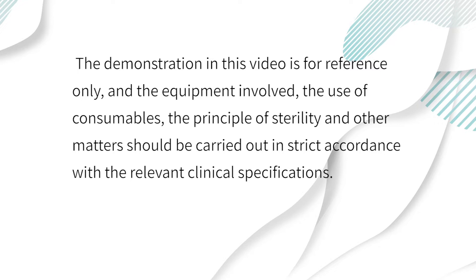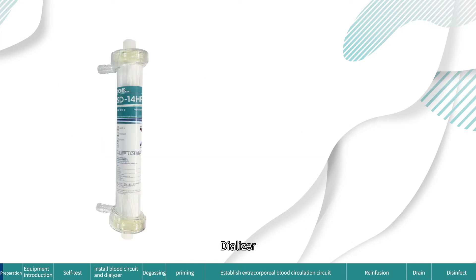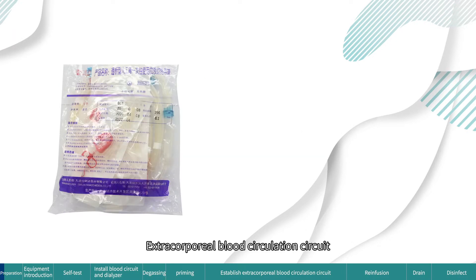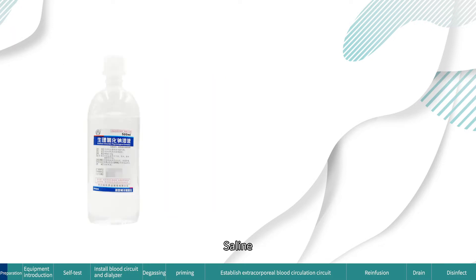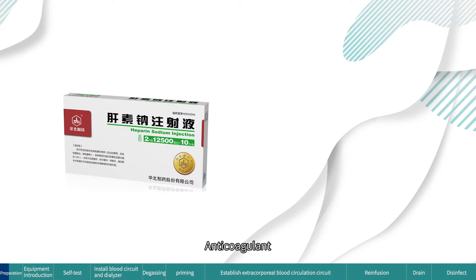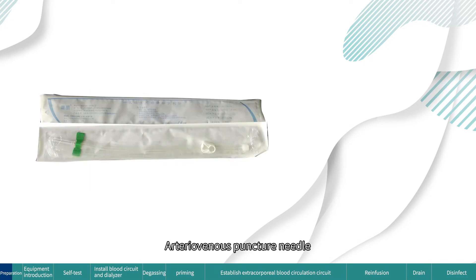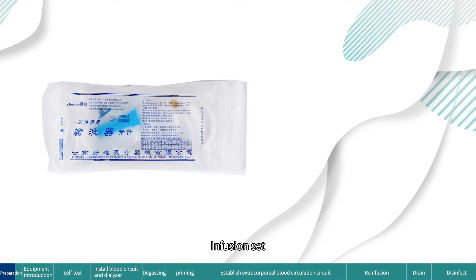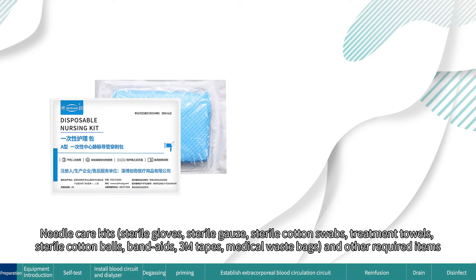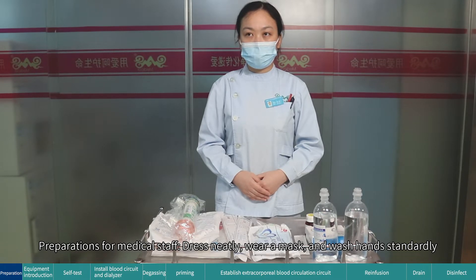Preparation items: dialyzer, extracorporeal blood circulation circuit, A/B concentrate fluid, saline, anticoagulant syringe, arteriovenous puncture needle, tourniquet, infusion set, needle care kits, and other required items. Preparations for medical staff: dress neatly, wear a mask, and wash hands standardly.